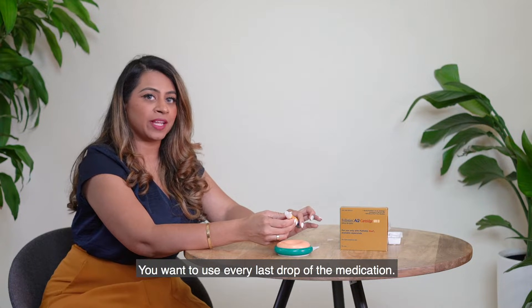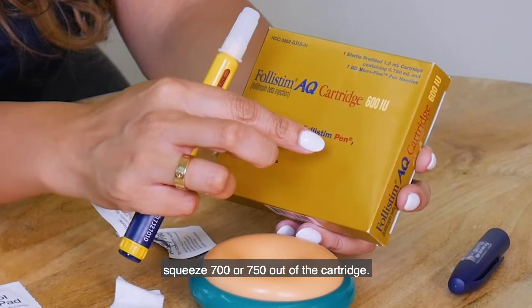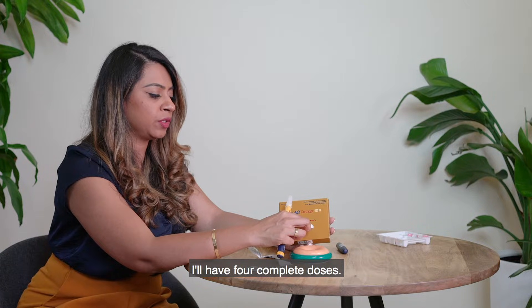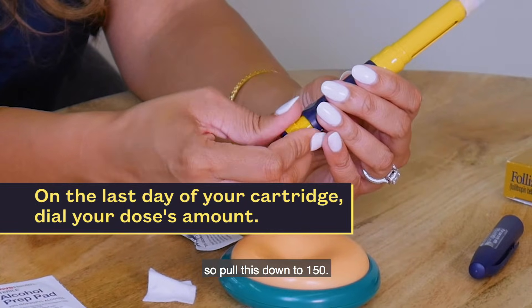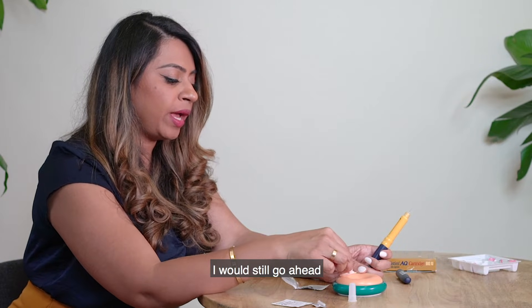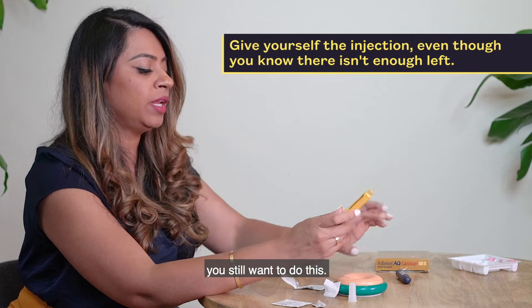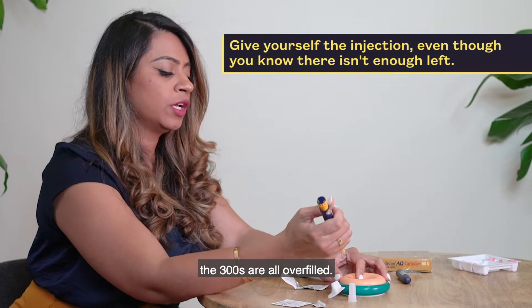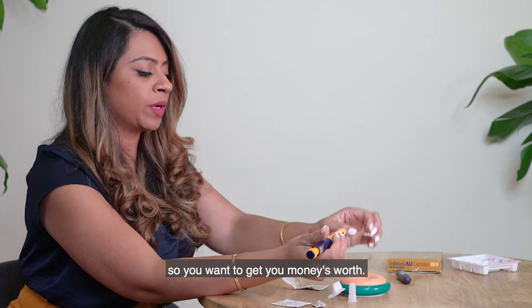You want to use every last drop of medication. Even though a cartridge says 600 units, you can sometimes squeeze 700 or 750 out of it. For example, taking 150 units per dose, you'll get four complete doses from a 600-unit cartridge. On the fifth day, still dial your dose to 150 and give yourself the injection anyway — the 600s, 900s, and 300s are all overfilled. Every unit of this medication is a dollar, so you want to get every bit of it.